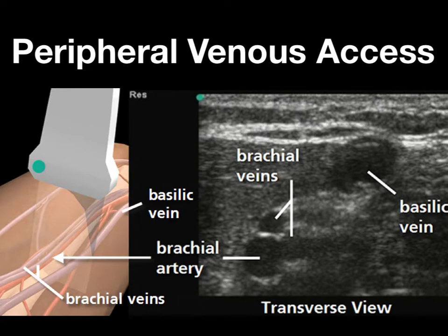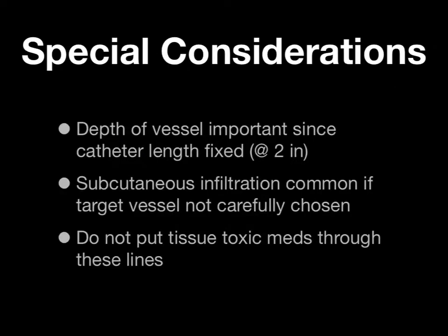venous cannulations. Let's take a look at some special considerations here. Remember, the vessels that you're going to be targeting with ultrasound guidance are deeper, so you're going to need a longer catheter, and this is where problems occur.